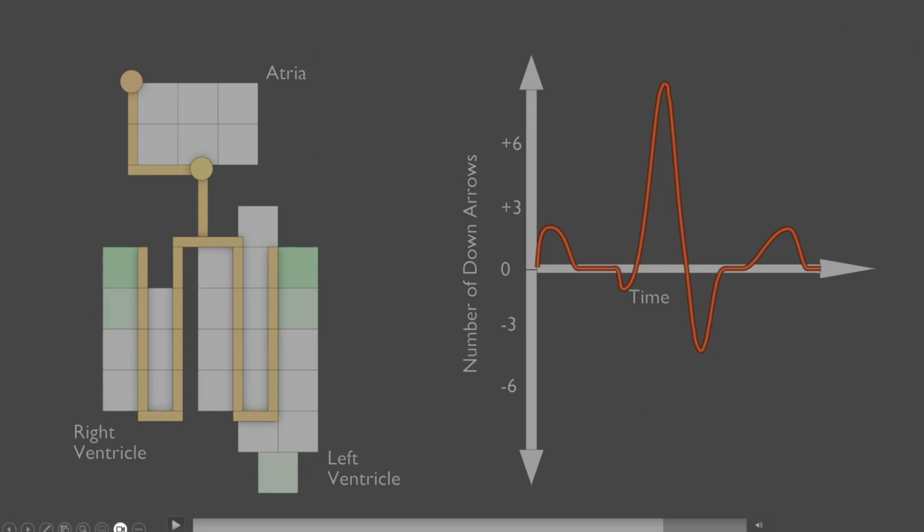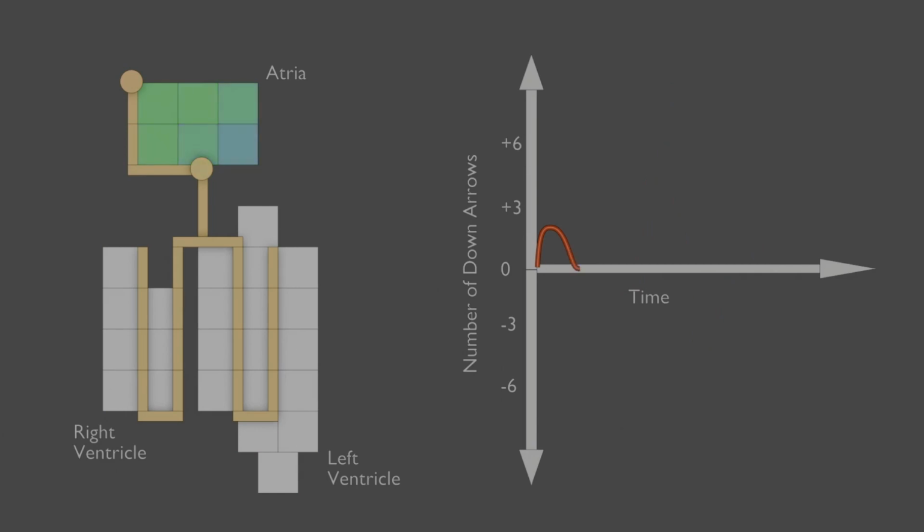But for the time being, I'm going to ask you to just trust me that the pattern that this repolarization makes looks something like that following the ventricular depolarization here, and then we end up back at the beginning. We'll let this cycle for a few times so you can watch it happen.